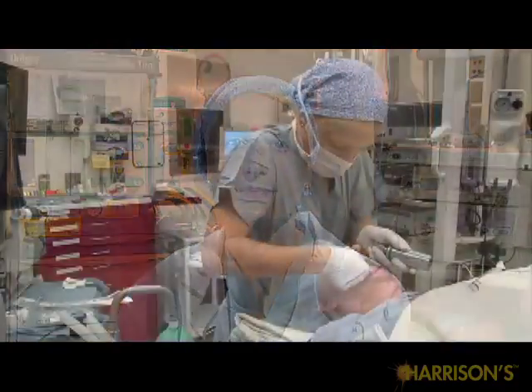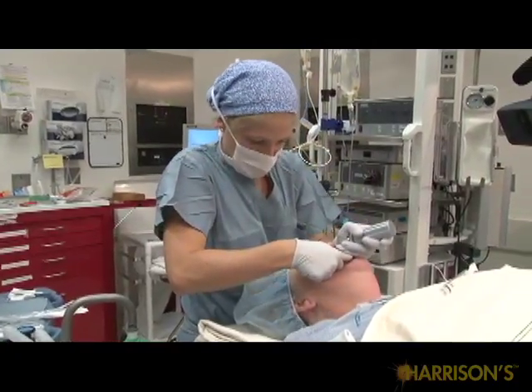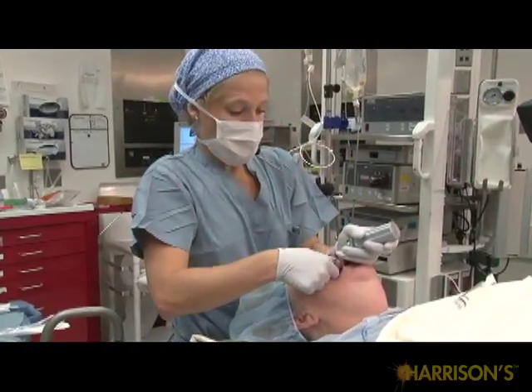Sufficient force perpendicular to the patient's mandible is necessary for cord visualization, but remember that bending the wrist and using it like a lever will not improve visualization, but instead will put the patient at risk for dental injury. In addition, check to ensure the patient's lip is not between his or her teeth and the laryngoscope to avoid lip lacerations.